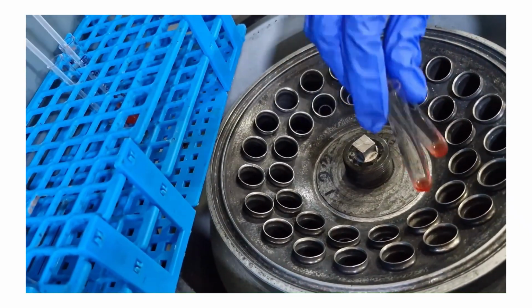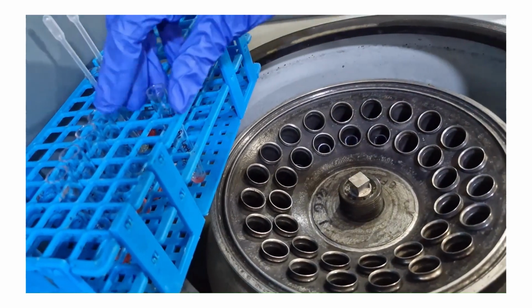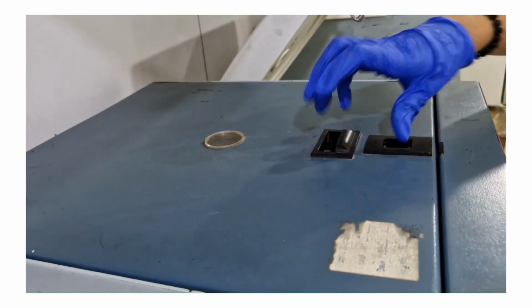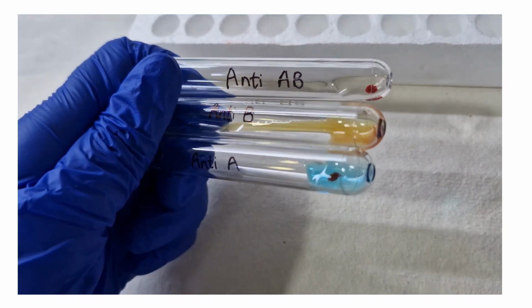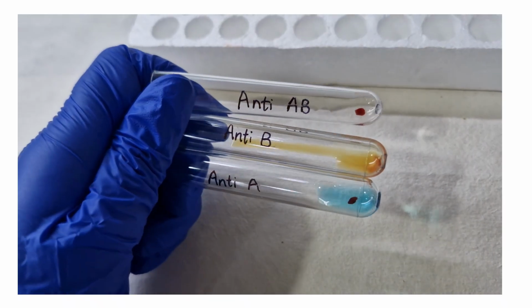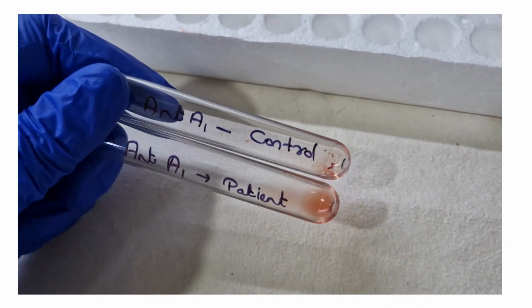Transfer all the tubes of forward and reverse grouping to the centrifuge, making sure to balance the tubes against each other. Then we will centrifuge according to the manufacturer's guidelines. Coming to results of forward grouping, in anti-A there is a strong 4 plus agglutination, in anti-B there is no agglutination, and in anti-AB there is a strong 4 plus reaction. In anti-A1 patient there is no agglutination, whereas in anti-A1 control there is a strong 4 plus reaction.